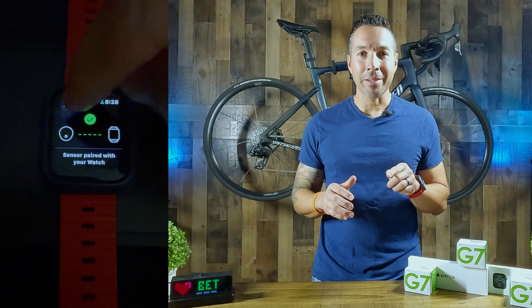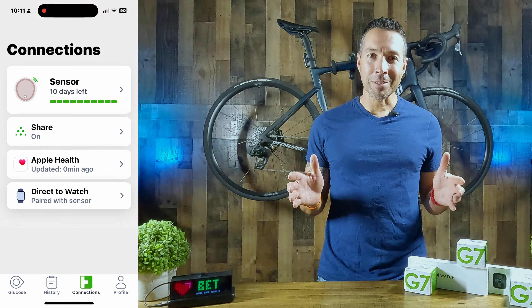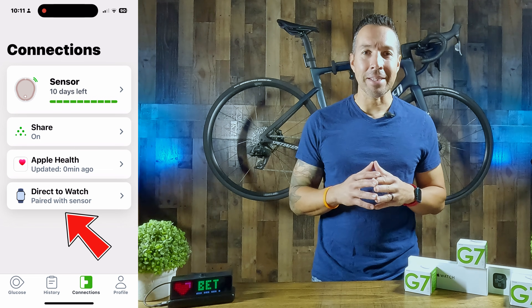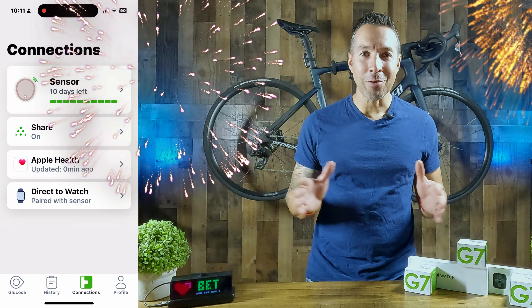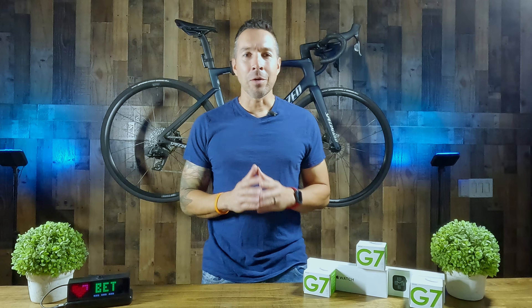The green checkmark indicates a successful sensor pairing with your watch. From here, you'll notice that the phone icon has disappeared, meaning that the pairing is complete. To verify this, open up your phone G7 app and click Connections at the bottom. You'll notice the Direct to Watch tab now indicates your pairing status. Congratulations, you've paired your watch and your sensor for the first time. Now, what if this is your first G7 sensor? I got you — let's set this up.